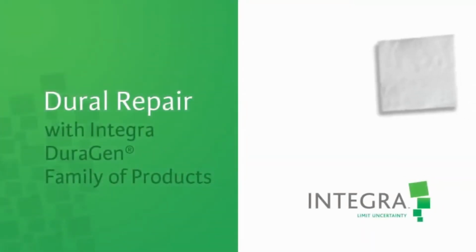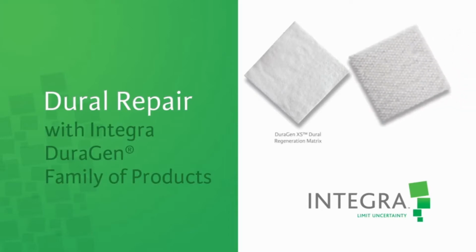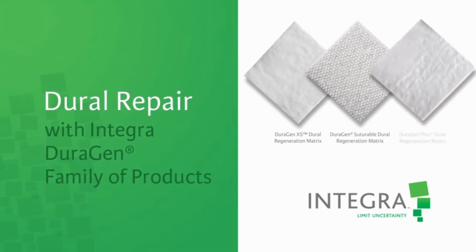The DuraGen graft matrix by Integra Neurosurgery is a unique and proprietary collagen graft for dural repair. Unlike any other system, the DuraGen matrix provides immediate closure to prevent CSF leaks and promotes natural dural healing, providing patients with real dura upon healing.